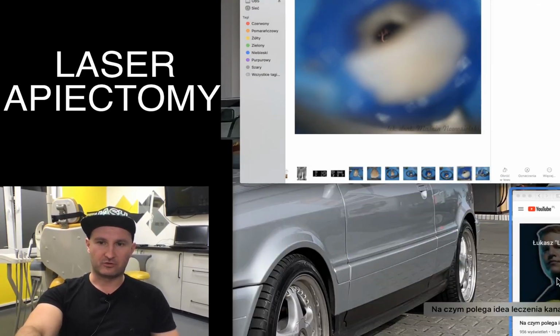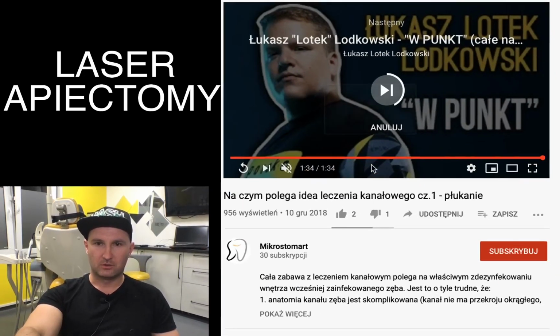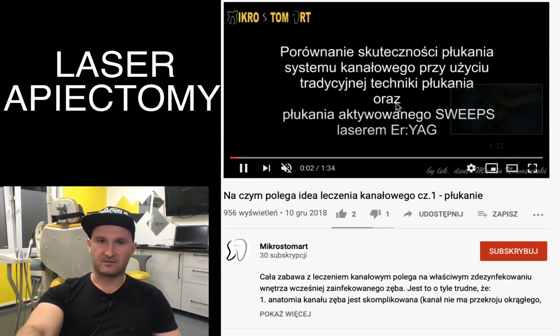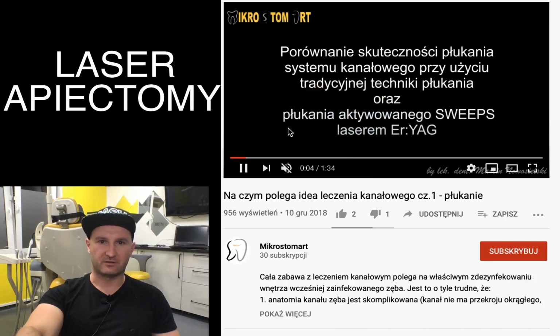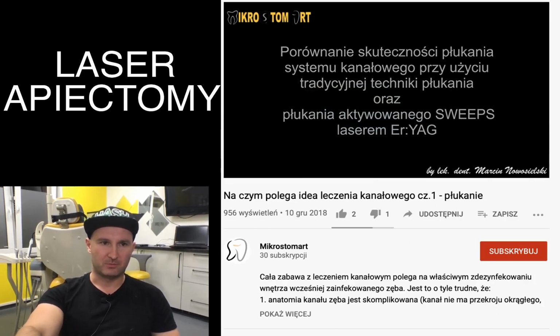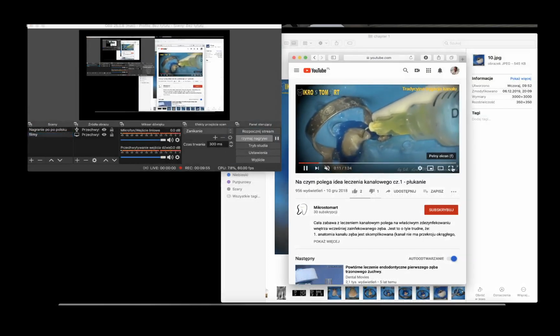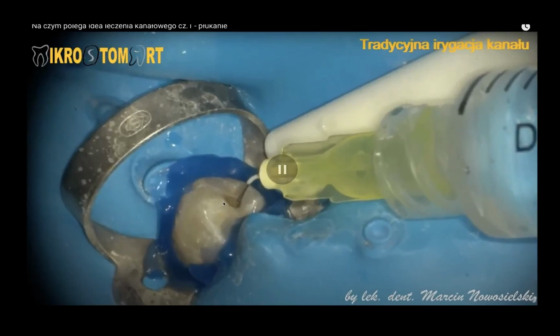So this is the first time when, in this case, we used laser. It was erbium YAG laser, and I will try to show you how it worked. This is the movie that I have recorded on YouTube. Maybe I will try to make it a little larger for you. So as you can see, oh, now it plays.